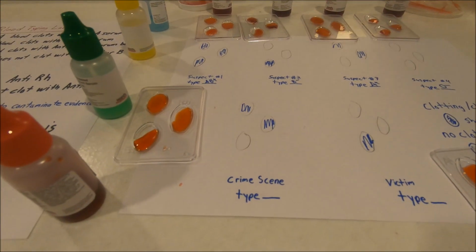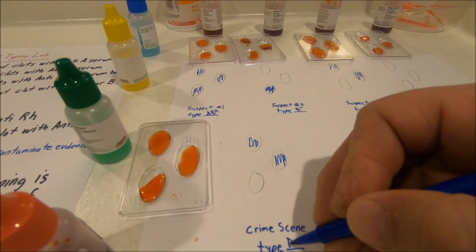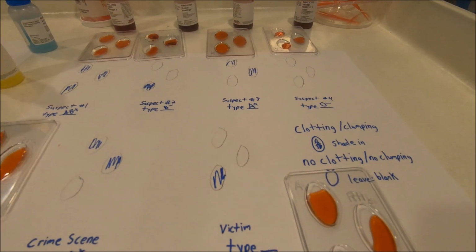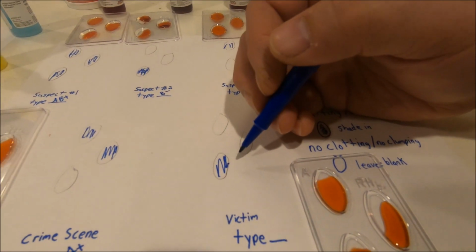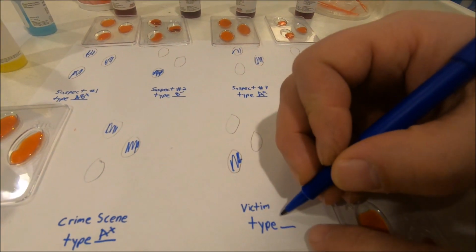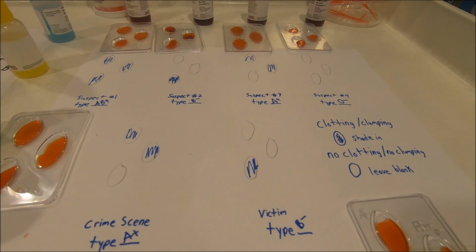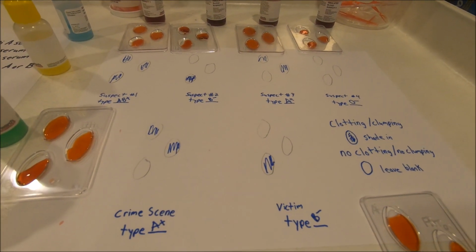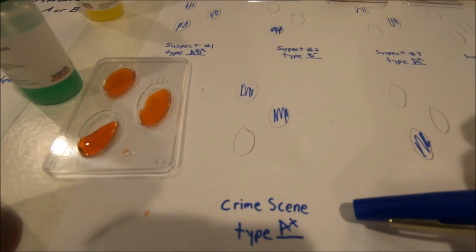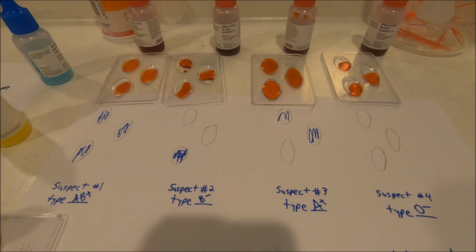And then finally our crime scene blood clotted with the A but not the B, so type A blood, and with the RH factor, so A positive. Our victim blood did not clot with A, clotted with B, and did not clot with the RH, so it would have type B negative blood. When we look at this information, the direct information we can take from this is that our crime scene blood, type A positive, matched suspect 3's blood, type A positive.